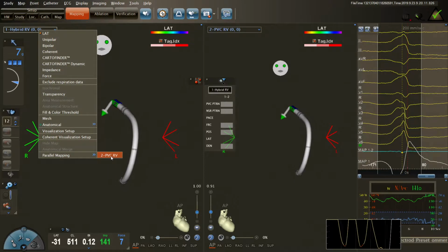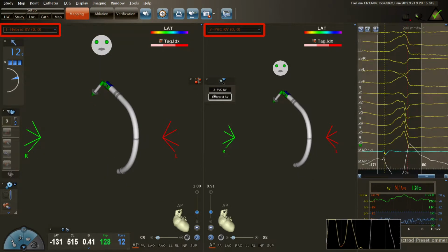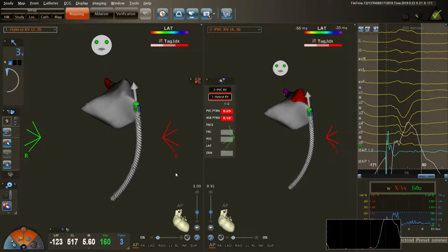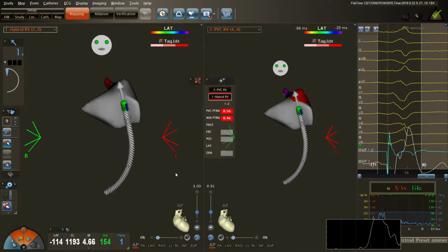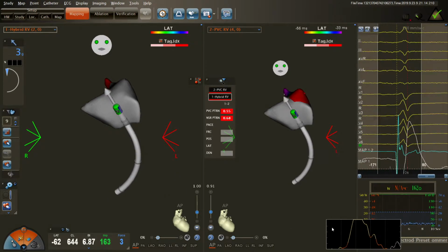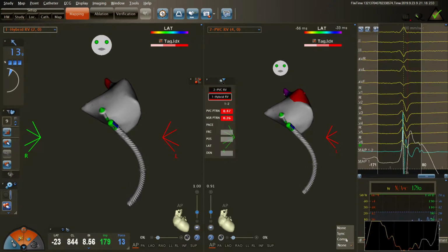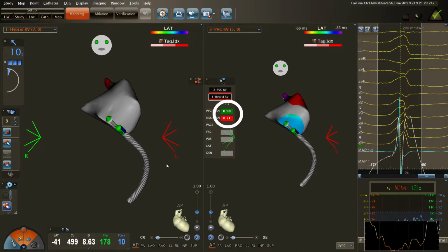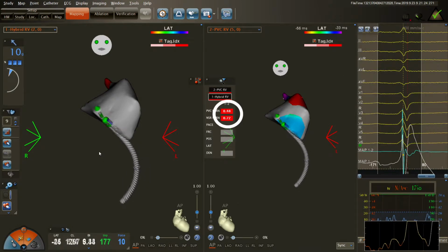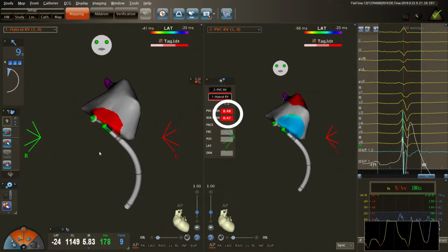After clicking on the map you want to pair, the maps become orange, which indicates that the parallel mapping function is correctly set on. So we start to map in the right ventricle outflow tract. We have to move gently with the catheter, trying not to produce too many extra beats not corresponding to the clinical PVC. You may see that when irritated PVCs occur, the pattern matching value becomes red, as the percentage of match drops below the threshold set.